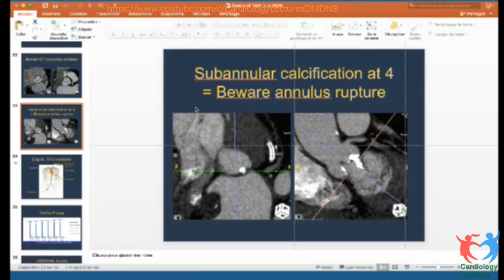What are the long-term results of this? All these valves are tissue valves. What about durability? Are they comparable to the surgical tissue valve long-term? Yes, for long-term now we have trials that give us good results for more than 7 years.